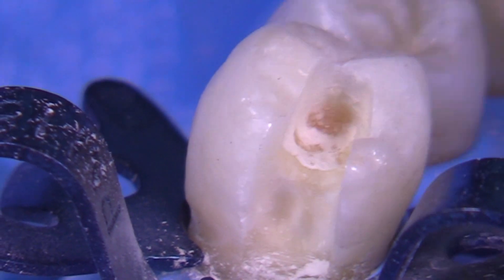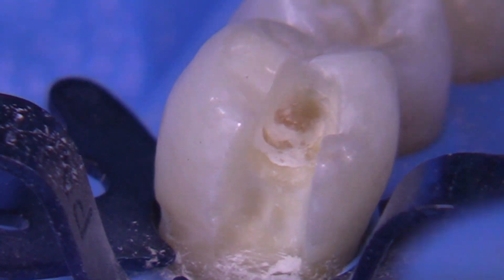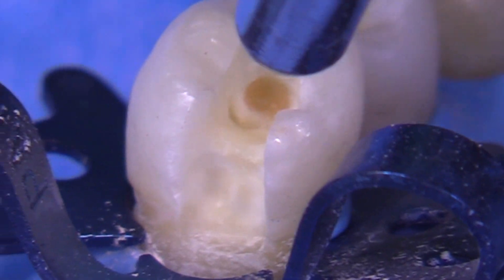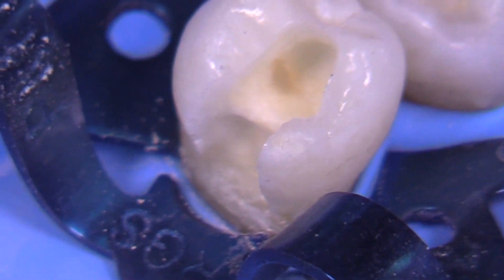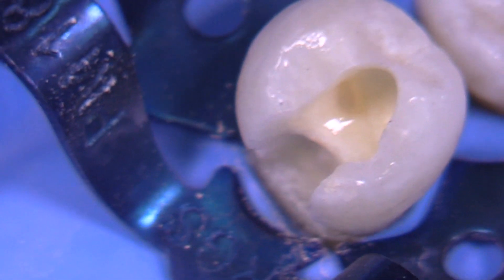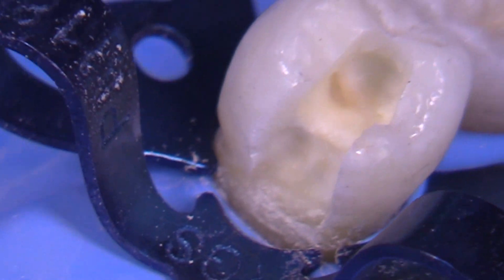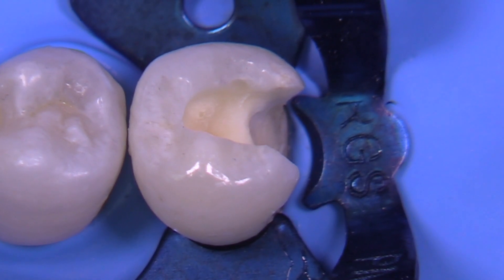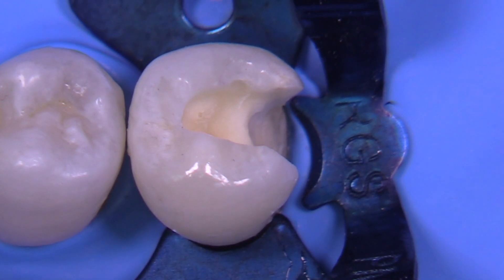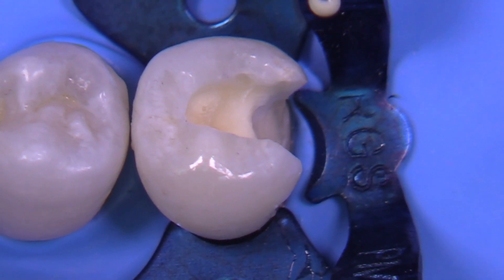Skipping between GV Black step 1 and GV Black step 5, alternating between those steps as we slowly surgically extend our boundaries. This is a detail-oriented procedure and one that is quite rewarding. You can see that we're so translucent there — we're basically right on the pulp horn just below.